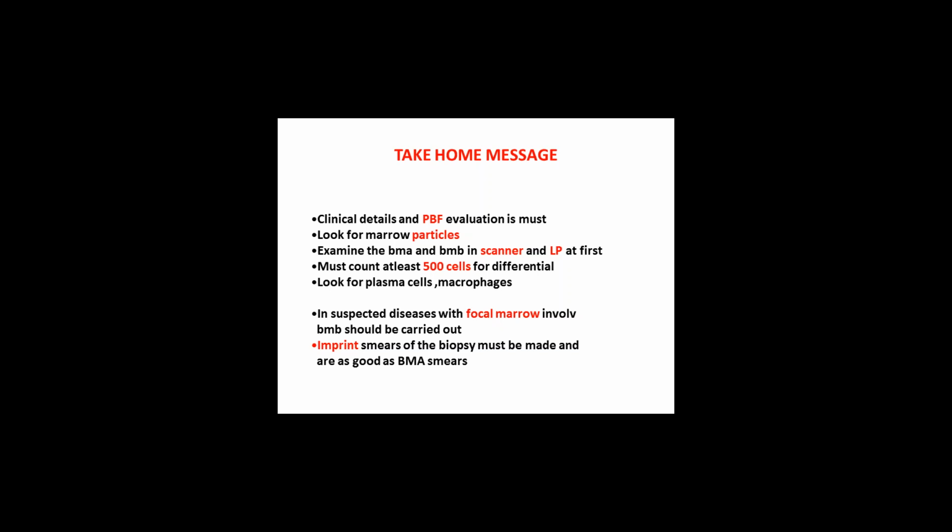Sir, what is the differentiation between multilobulation versus multinucleation? In multinucleation, there will be separate nuclei. They will be away from each other. You can count them separately.